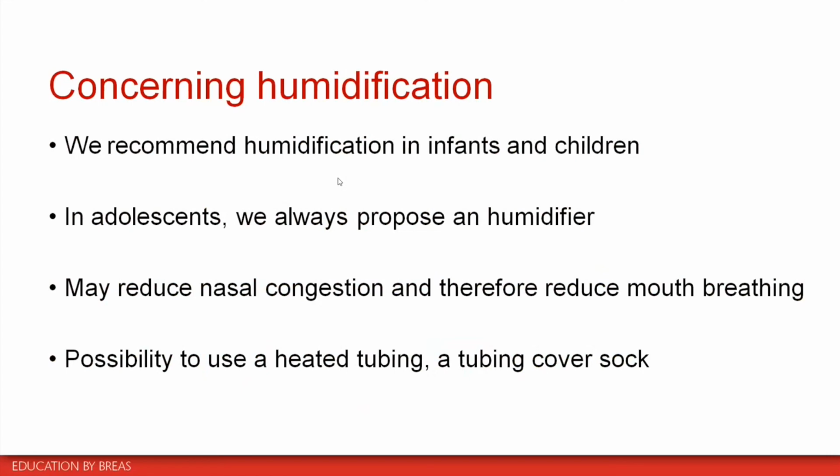A possible solution is to try to adapt heated tubing, or even to propose a tubing cover sock, and in many cases it is enough to have a good humidification without having the problem of nose and mouth dryness or water condensation inside the tubing.